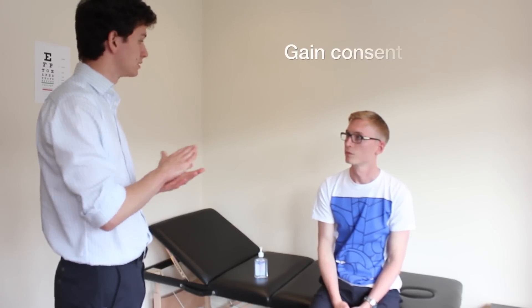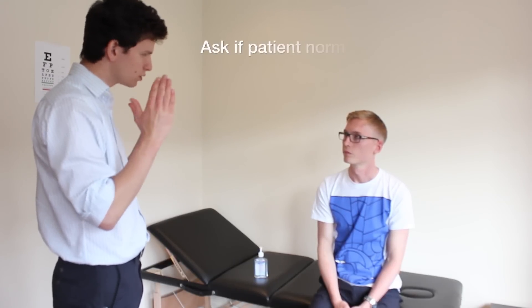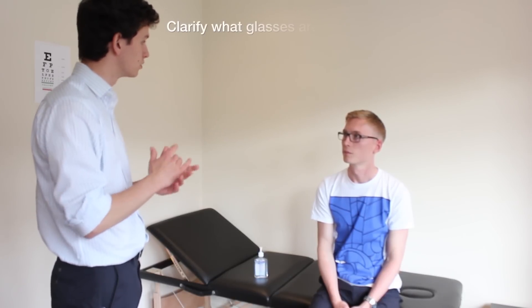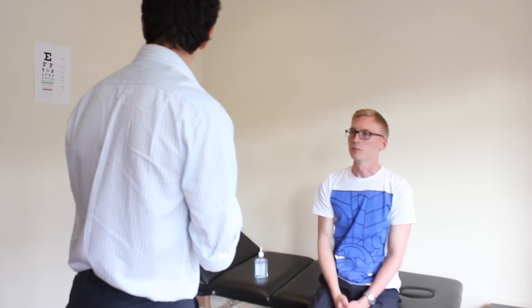It's going to involve me testing your eye movements and getting you to read as well. Can I ask what you use your glasses for? Do you use them for long distances, like a cinema screen, or just to read at short distance? Just for long distances, I don't use them for reading. Okay, that's absolutely fine. So if you keep those on for me, we're going to test your vision now.